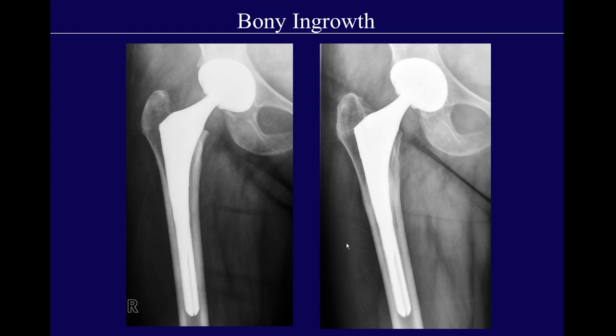Notice there's a slot in the distal aspect of this femoral stem, and in a slightly different projection, you can actually see what are called splines. This is important because if a prosthesis is too stiff, it can cause thigh pain. Some stem designs have this slot to decrease stiffness. They'll also have splines, which are ridges, and flutes, which are grooves. Both decrease the stiffness of the distal prosthesis and also provide some rotational stability.